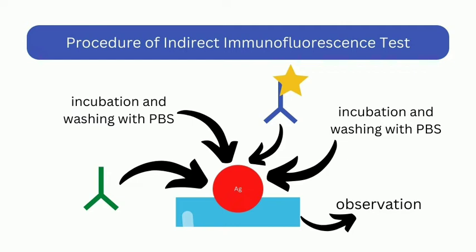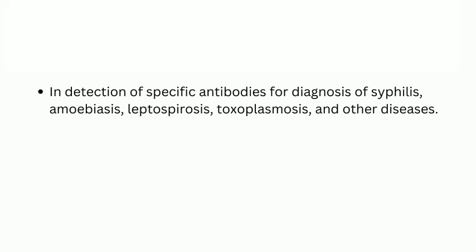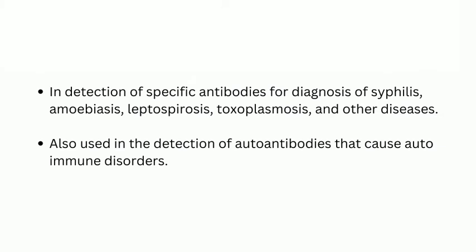Its uses include the diagnosis of syphilis, amoebiasis, leptospirosis, toxoplasmosis and many other diseases, and also the detection of autoantibodies which cause autoimmune disorders.